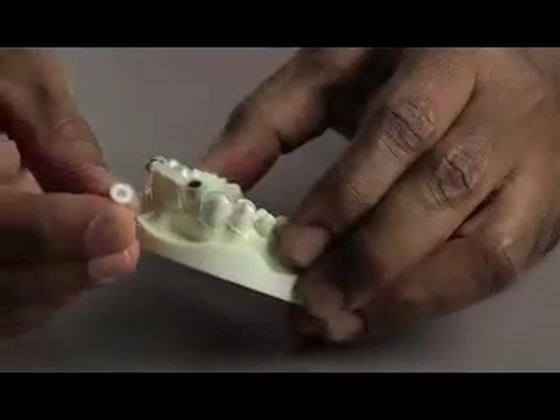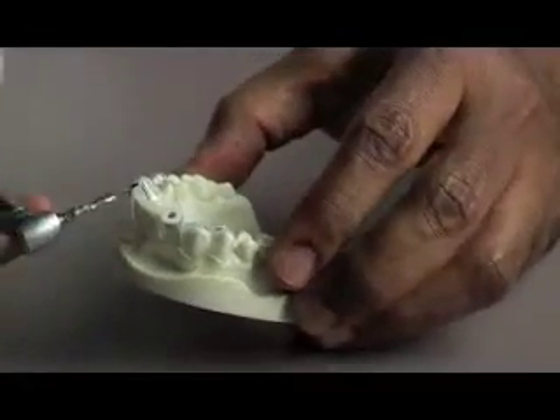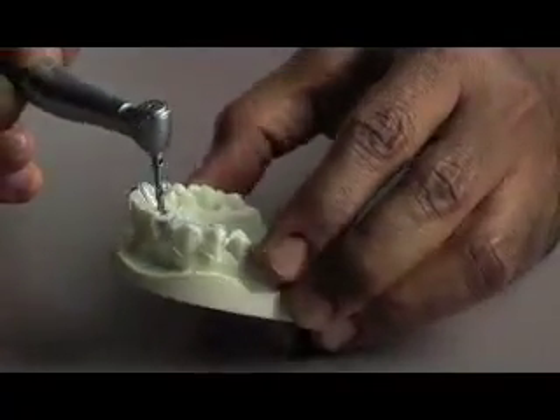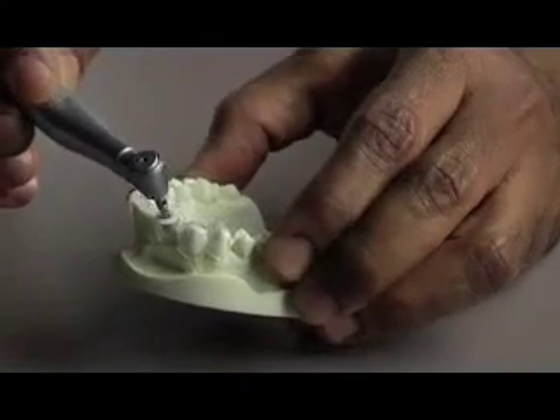A small sleeve is put into the same hole, then the implant drill can only go one way — it goes right in and will go to exactly the proper depth. The way we do the implant is called a top-down approach.